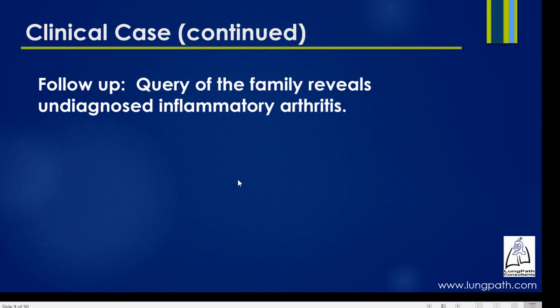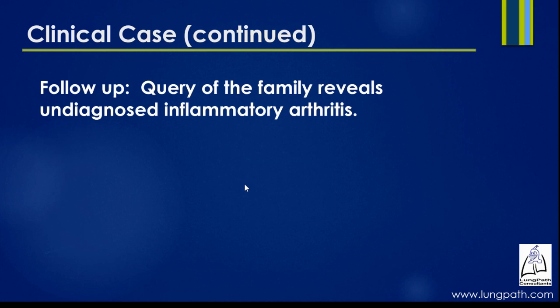Diagnose this as acute injury with hyaline membranes, which for many of you, you know this is also known as diffuse alveolar damage, which is a pathologic pattern. It's not truly a diagnosis. If this were a tumor, you would diagnose it based on its morphology, but for patterns of inflammatory interstitial lung disease, the pattern is just the beginning of the exploration. So you need to know what the differential diagnosis for diffuse alveolar damage is. And we'll talk about that throughout the presentation.